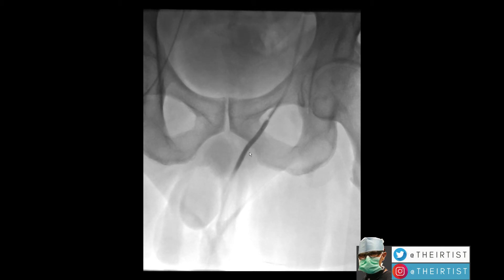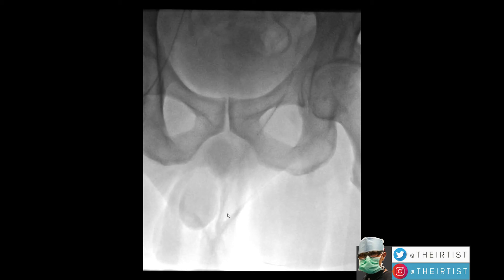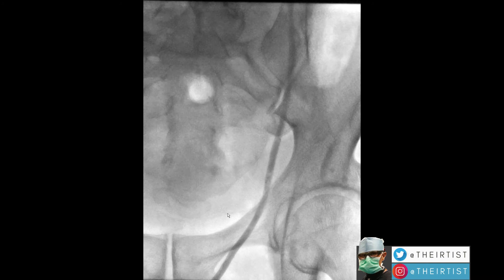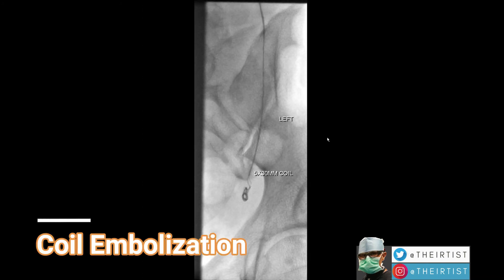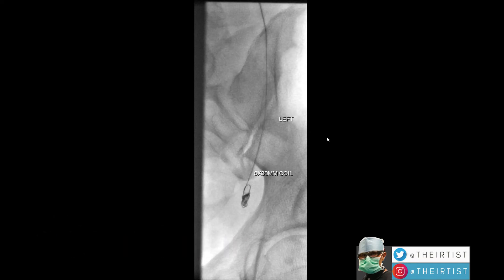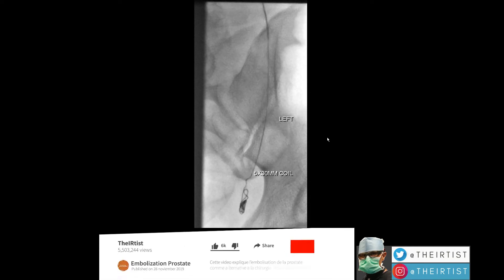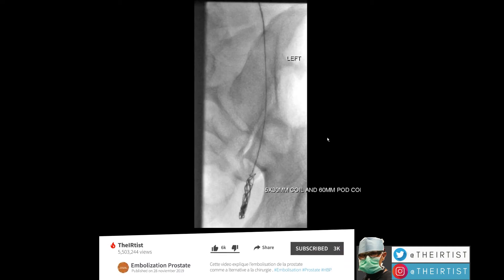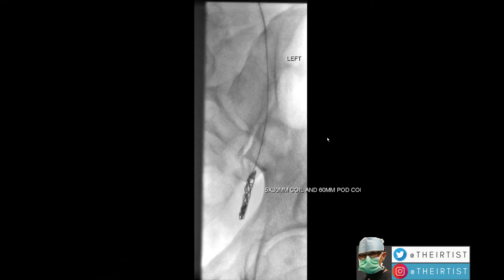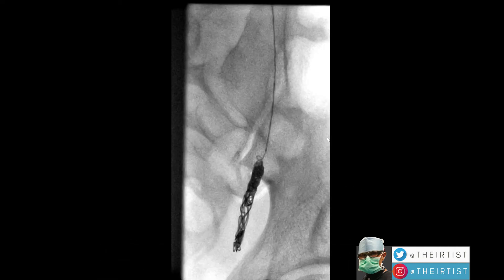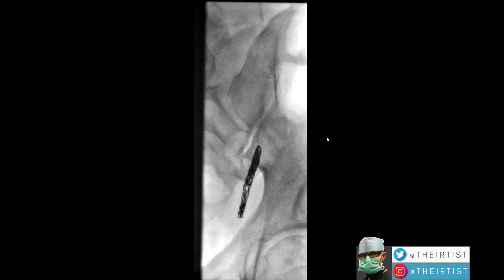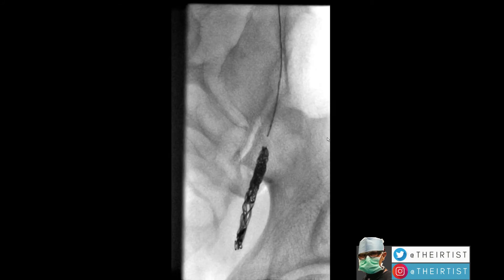We don't embolize at this lower level — the embolization should be higher than this. This is just for imaging. Then we place coils that will occlude the vein. The coils don't just occlude the vein; they cause it to ultimately shut down. We then check after the coils are deployed to make sure that everything is occluded, using the venogram.